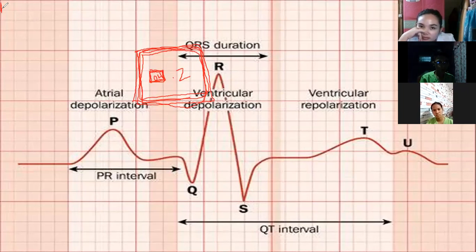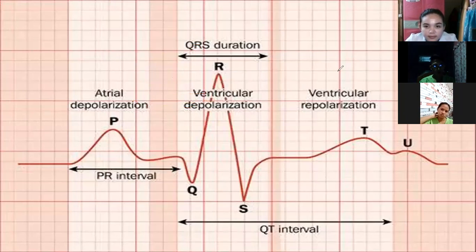So i-take note nyo yung mga bunso kasi nagbibilang tayo. Pag may hangganan na ganyan, ibig sabihin may 60 beats per minute na eh. Hindi ko ma-send po itong picture. Ang hirap pala pag ganito, no? Pasensya na kayo kung naguguluhan o nalilito kayo, ha? Yung iba kasi parang napapakamot na lang.